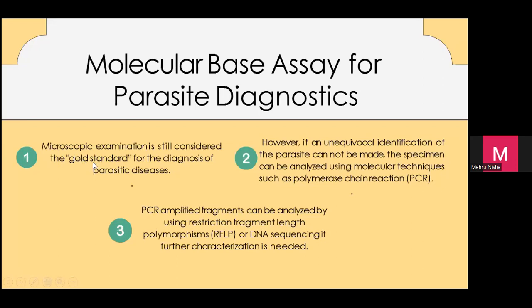Kalau virus, you have to culture in cell. Fungal, you culture dengan agar. Lepas tu you can do PCR and so on. Tapi kalau parasite, you still go microscopy. Why do you think so? Mengapa anda rasa untuk parasite microscopy is still the golden standard? Any opinion?